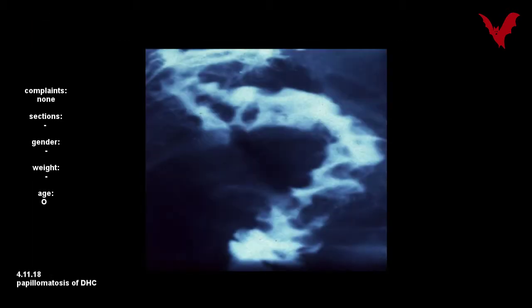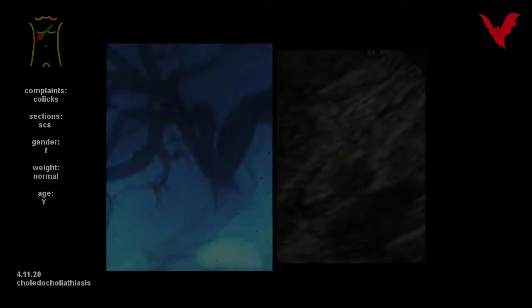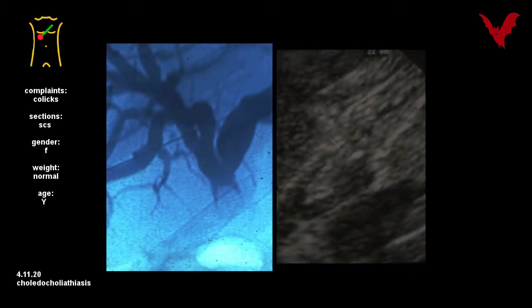Further therapeutic option in this old patient in 18 was simply palliative stenting. X-ray in ERC gives in this figure 19 less information as compared to clinical ultrasound. After a bile digestive anastomosis some years ago, the stone in figure 20 was successfully treated by ESWL.